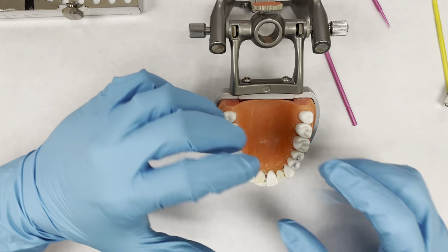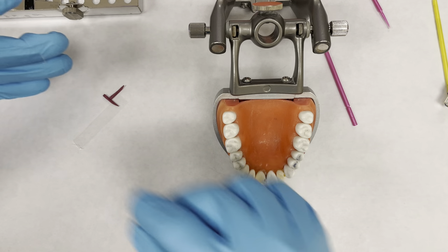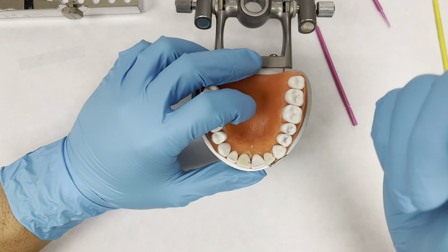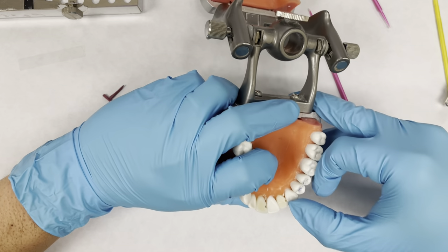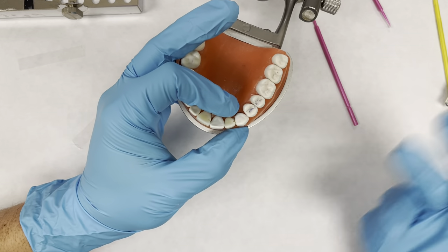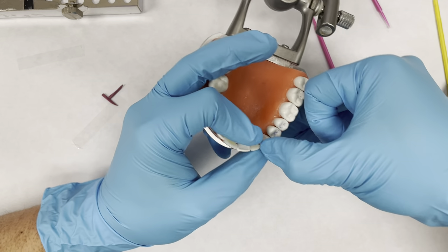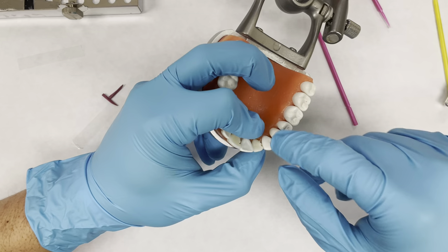When you're getting the rubber dam on there, it can get a little frustrating because the contacts are so tight. You may not be able to get your micro brush in there underneath the rubber dam every time. So if you have a thick fingernail, you can just shove it in between the teeth, create a little separation, and that'll help the rubber dam pop down. Basically take your thumb, shove it in the proximal while you're pulling down on the rubber dam, and it'll just pop right in.